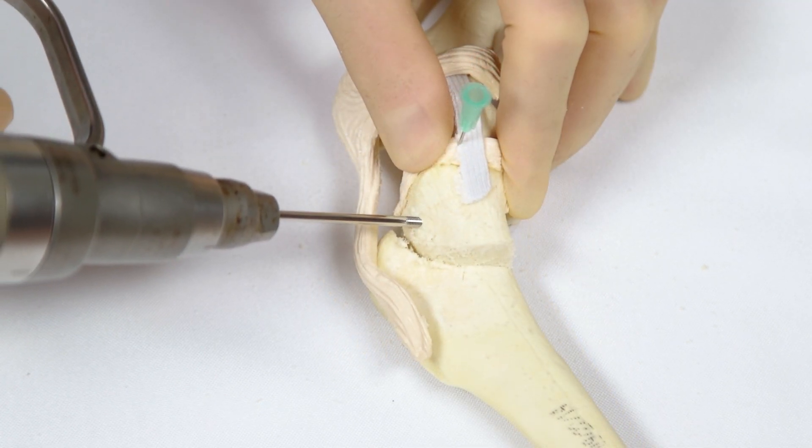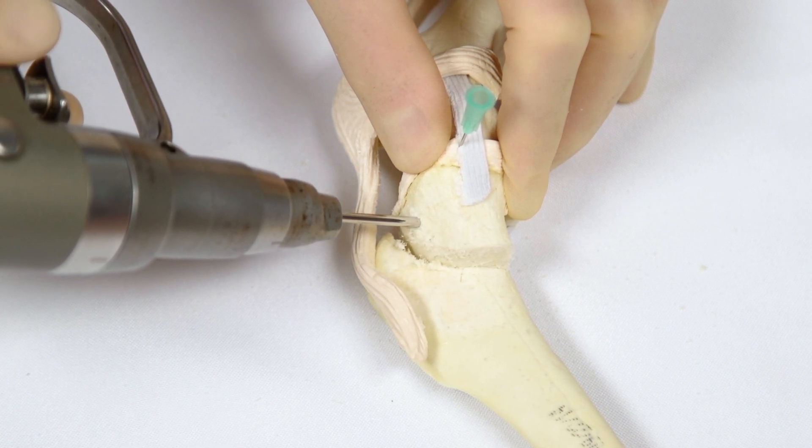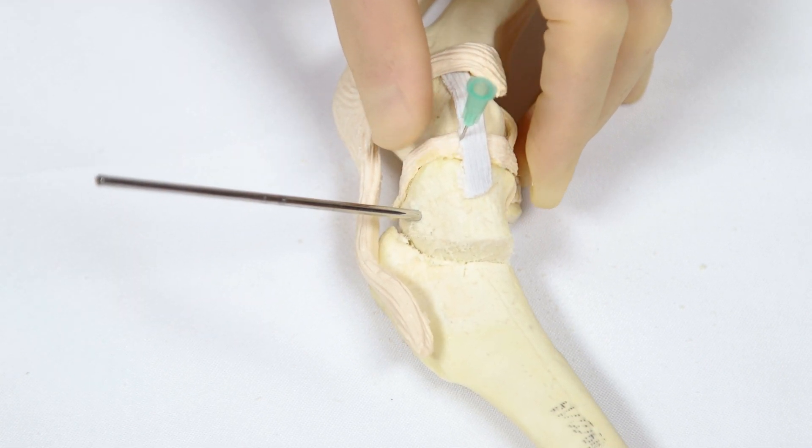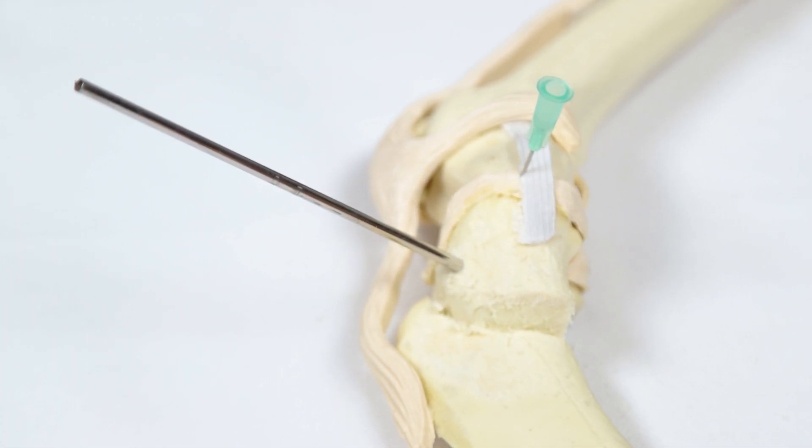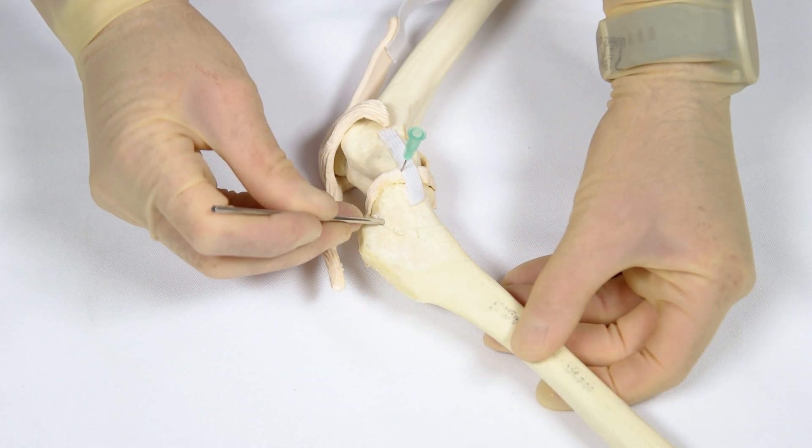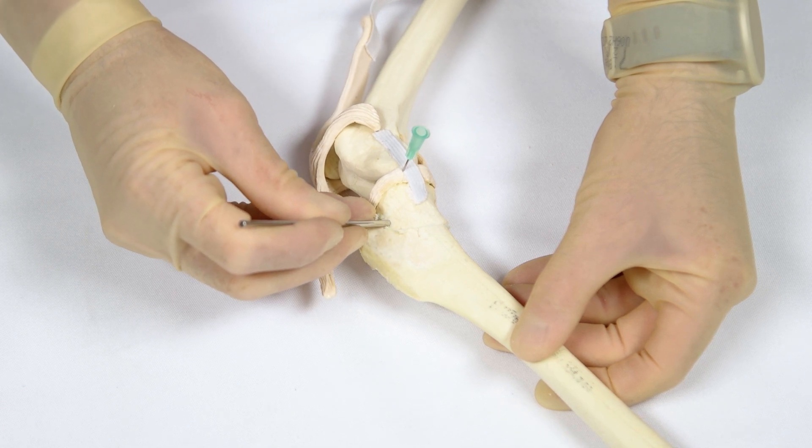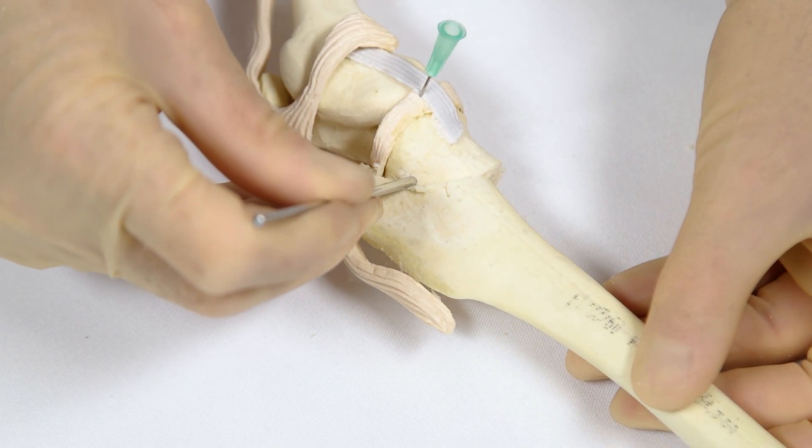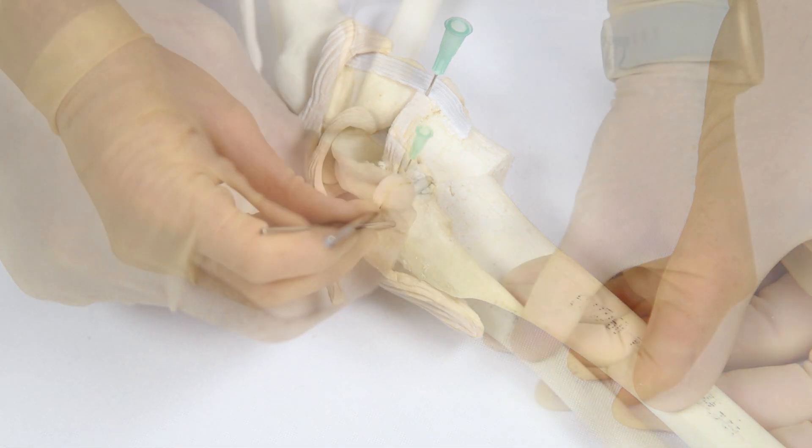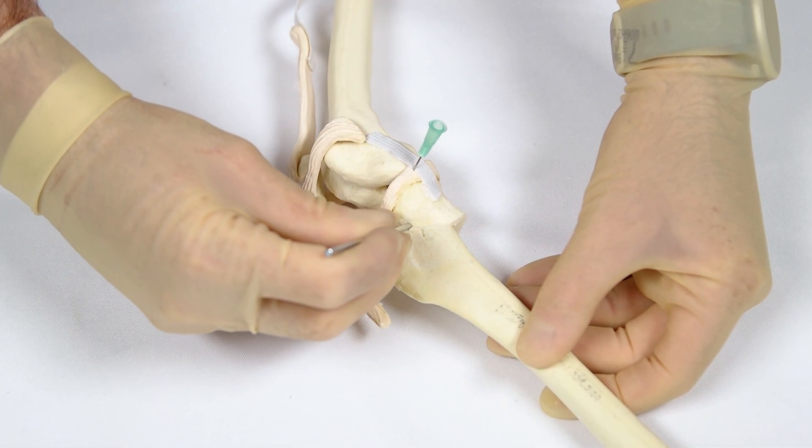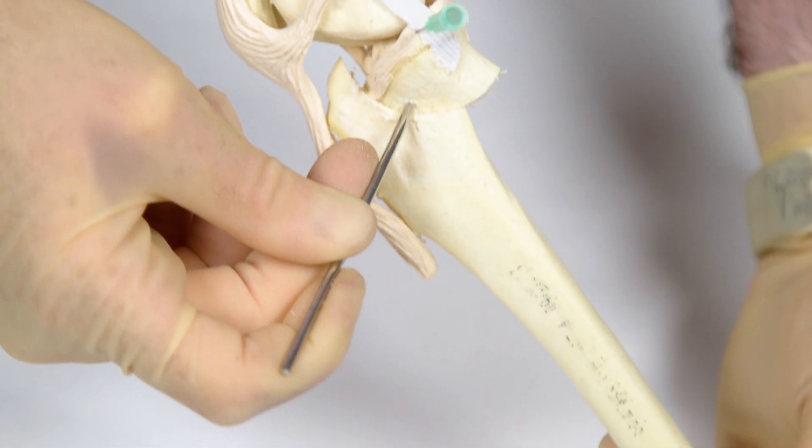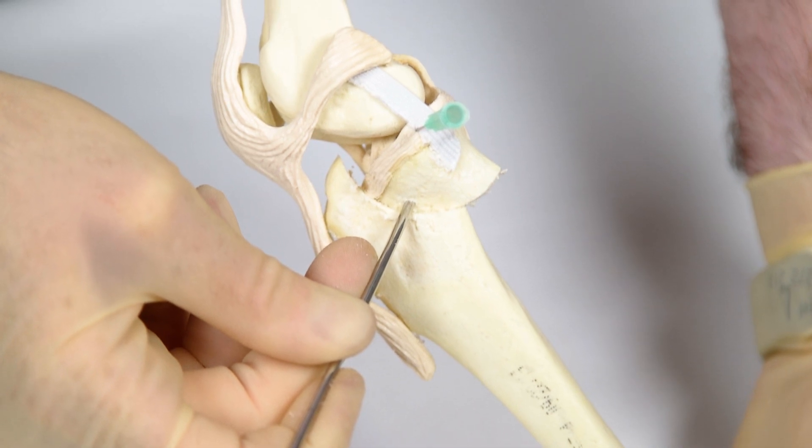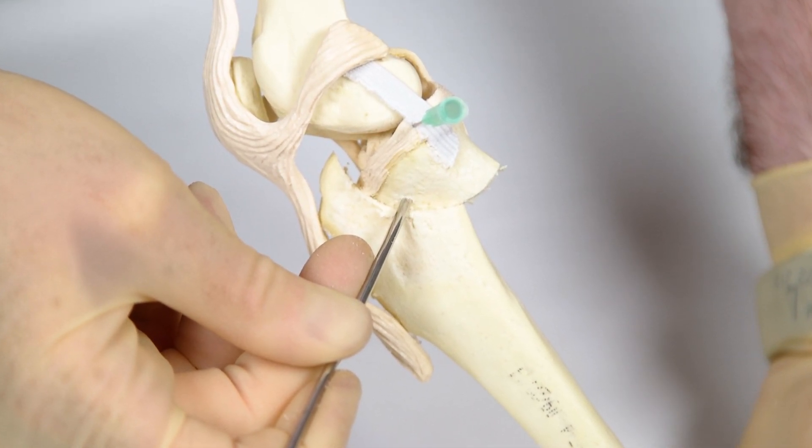An Ellis pin is placed in the cranial proximal tibial plateau just under the cut surface of the joint capsule. The pin should be angled about 30 to 40 degrees to the horizontal and aimed towards the caudal tibial cortex. The Ellis pin is used as a handle to rotate the tibial plateau along the arc of the osteotomy, taking care not to create any internal or external rotation of the tibial plateau during rotation. When the rotation marks line up, the tibial plateau has been rotated the correct amount.